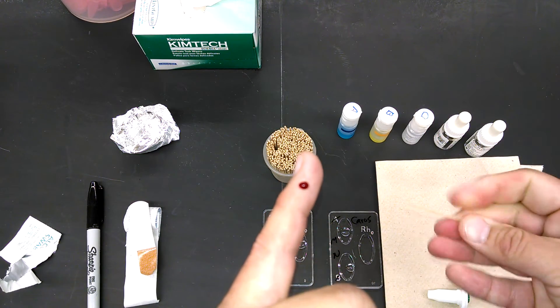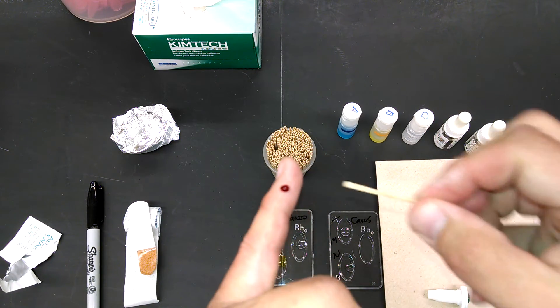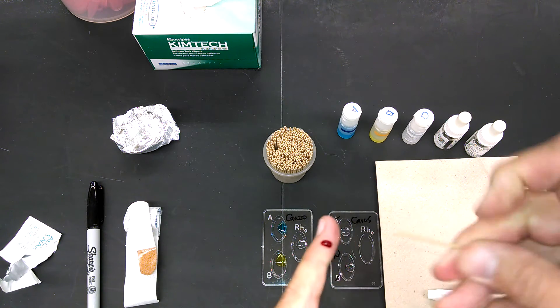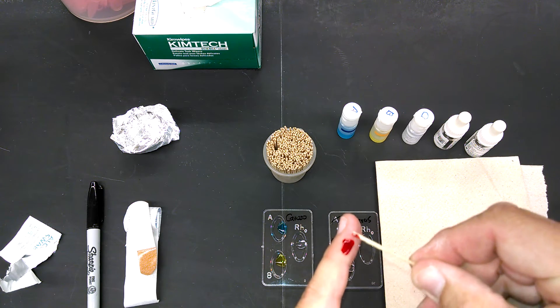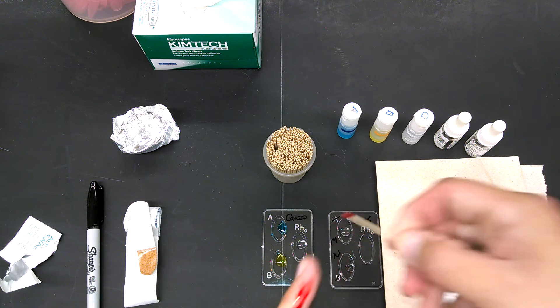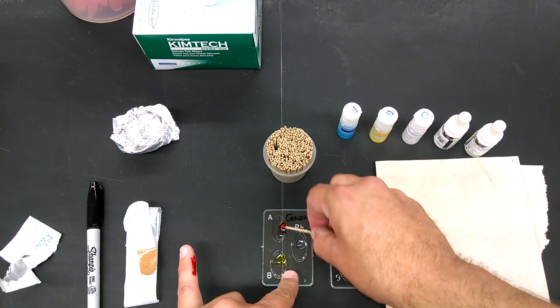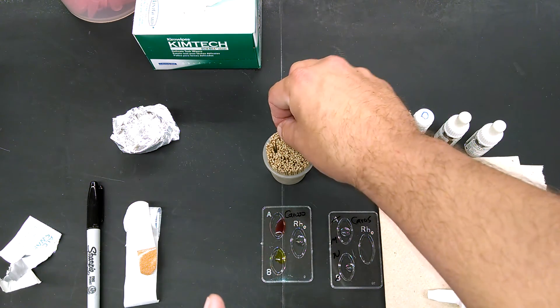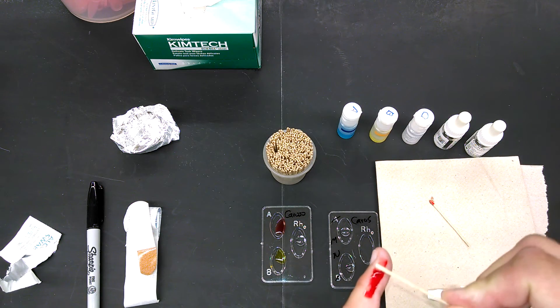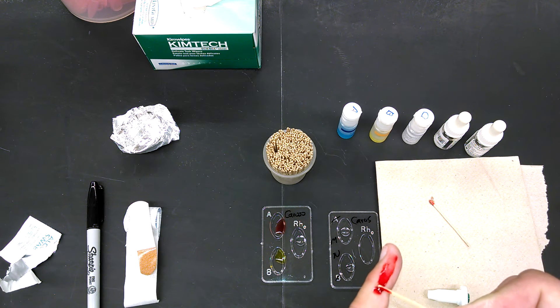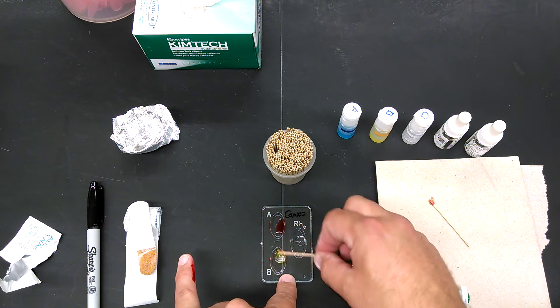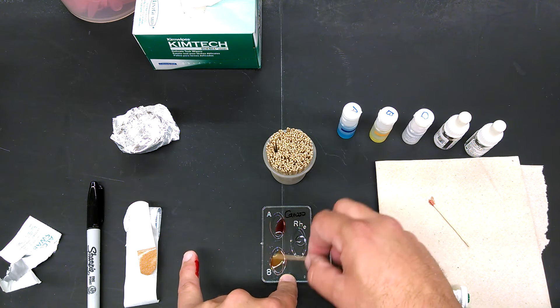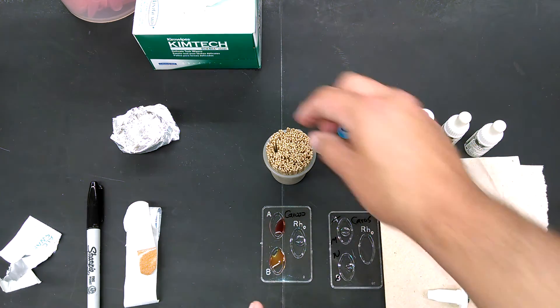Take a toothpick. You're going to use a new one every time. You're going to scoop some of it up and swirl it around in the antibodies. You need enough that you can see it, but not too much. And then a new one. If all you can see is a tiny amount, you won't be able to see a reaction.